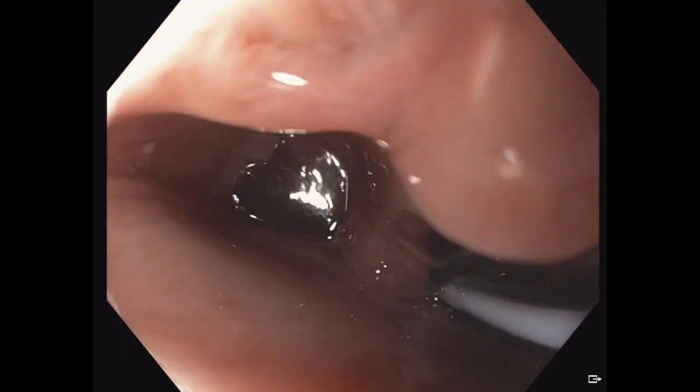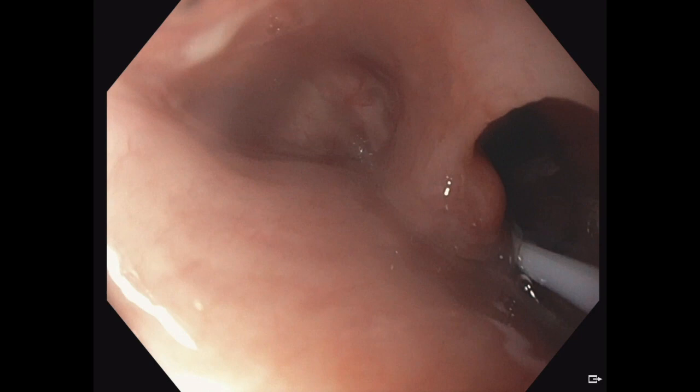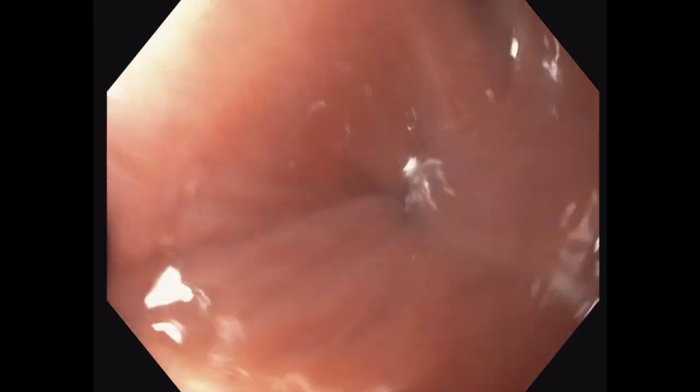This patient had general anesthesia, so you can't see the vocal cords, but the observation of laryngopharynx is important, especially for the patient with risk factor of oral cancer, such as smoking and alcohol, as well as patients with laryngopharyngeal reflux symptoms. The entrance of esophagus is located slightly on the left side, so I prefer going from this side, but it's just a personal preference, so pick the side easier for you.